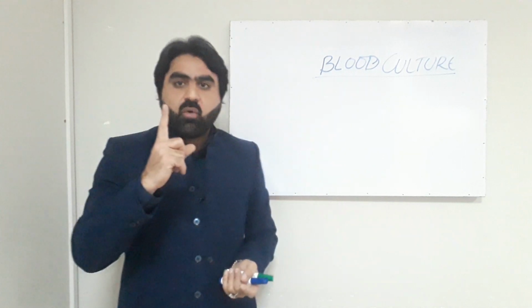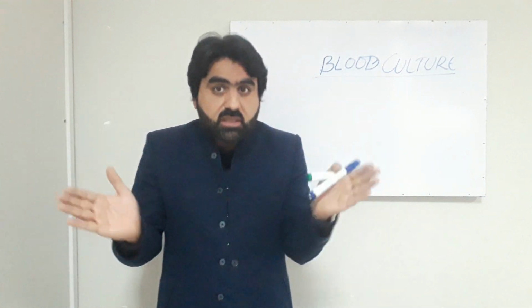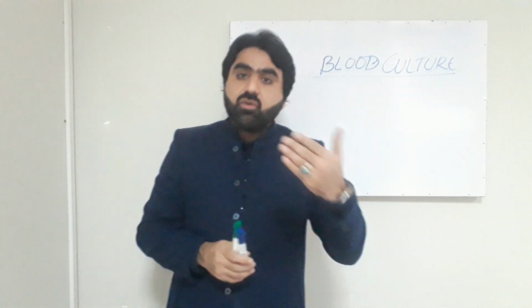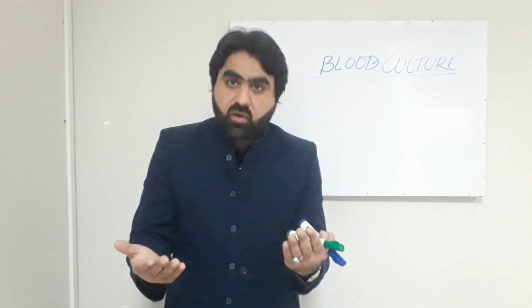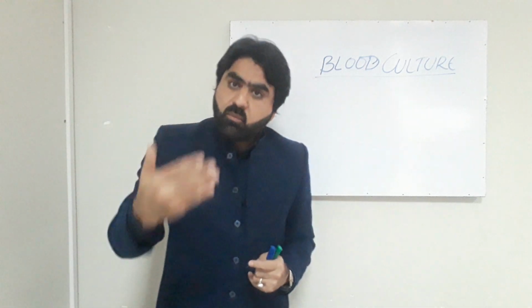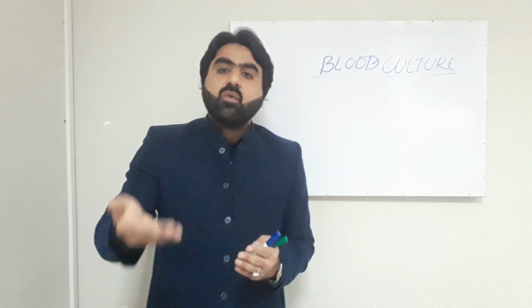If more than one bottle is positive in 2 or 3 blood culture sets, and you perform subculture and gram staining, and you come to know that the organism is one and it is pure in nature, then we decide that it is bloodstream infection.